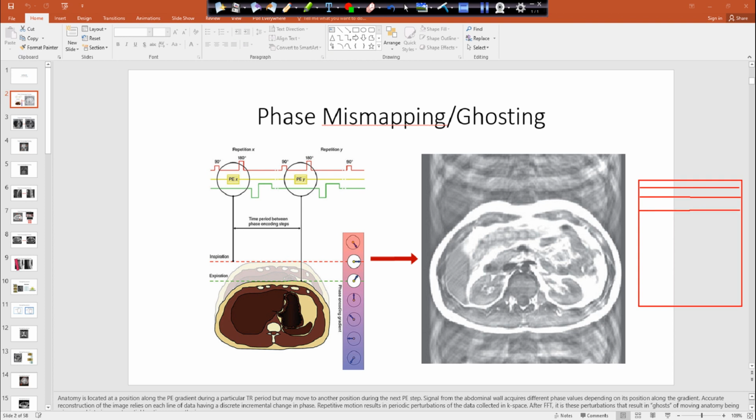So what are the rows of K-space? Is that the phase or the frequency? Rows. Phase. So just a quick review on K-space. Remember, the top is always equivalent to the bottom. The right is always equivalent to the left. And the center of K-space is usually what? Our signal or our resolution? Signal. And then the periphery is our resolution.